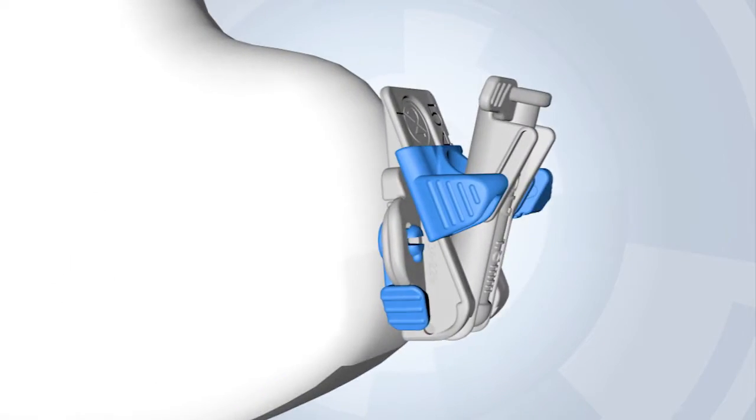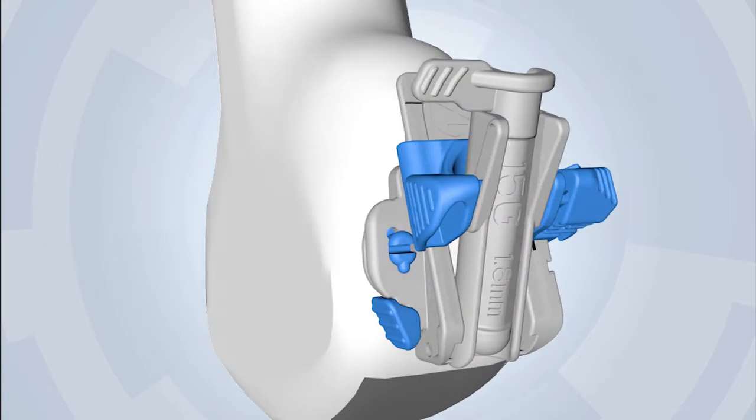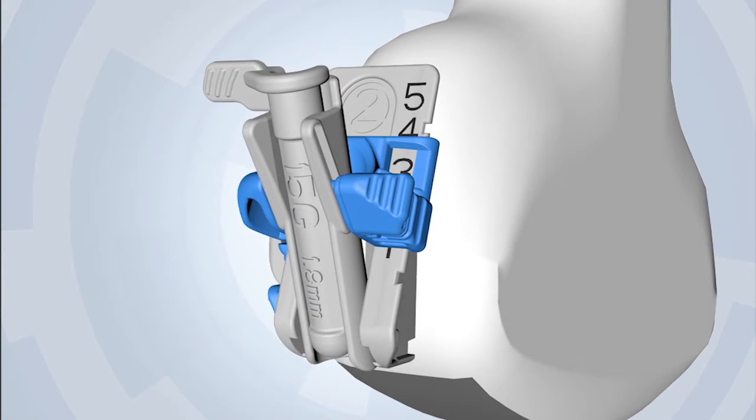With proven benefit, needle guides have been and will continue to be part of the foundation for performing ultrasound guided interventions.